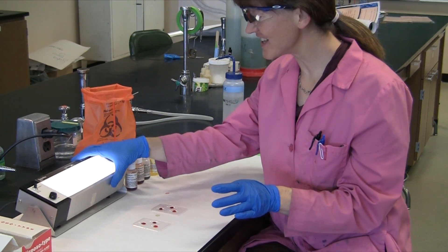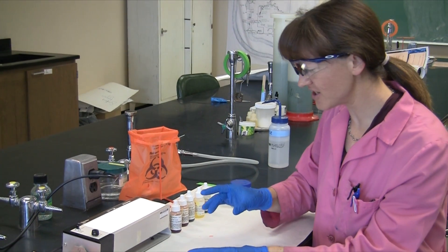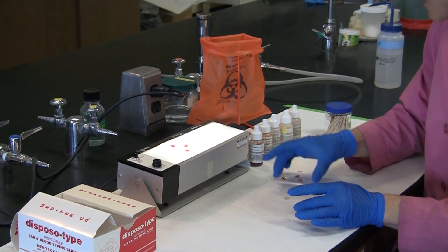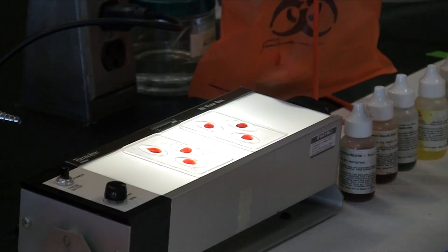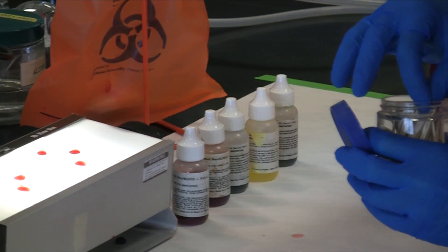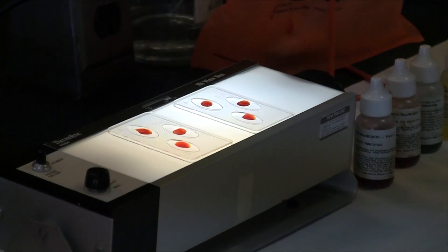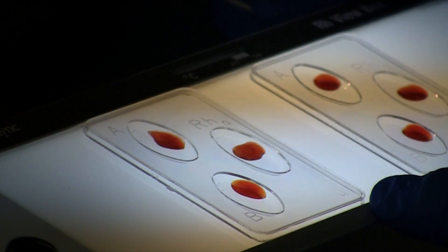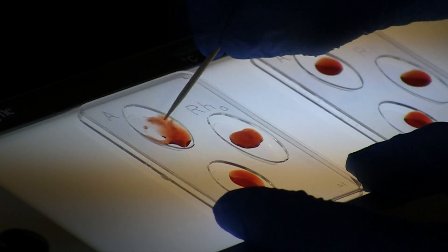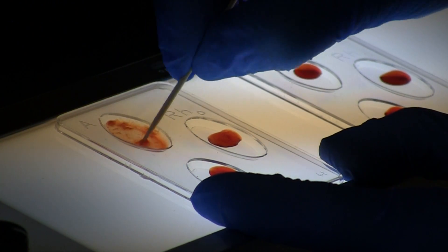Now we're set. We have a handy little light box that we can put these on to allow us to see the agglutination a little bit better. We'll set these onto the light boxes and then mix with a sterile toothpick to see if we can see the agglutination.